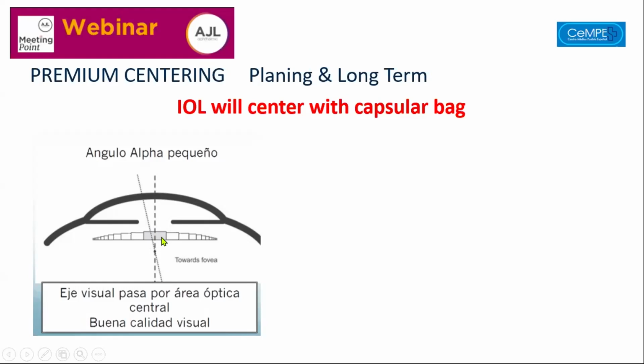So in the case of mostly diffractive lenses, you ensure yourself that the center of the lens and the center of the visual axis have higher chances of being aligned. And this will provide your patient with happiness because of good visual quality.